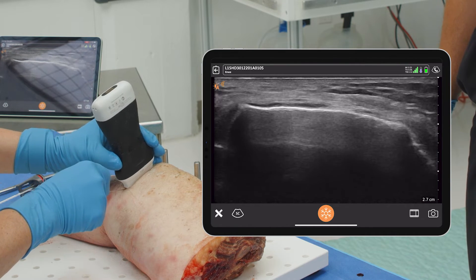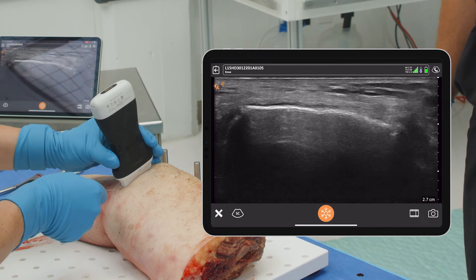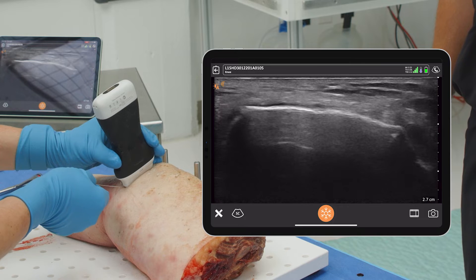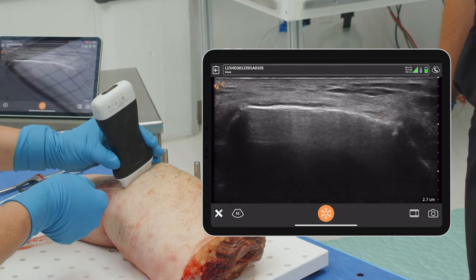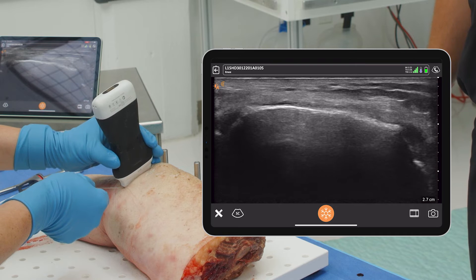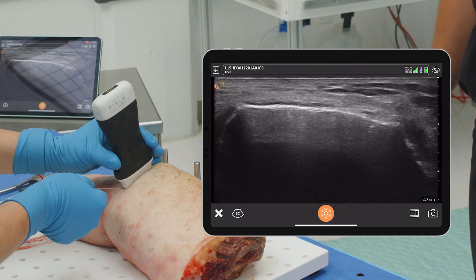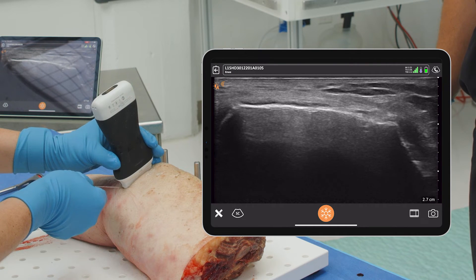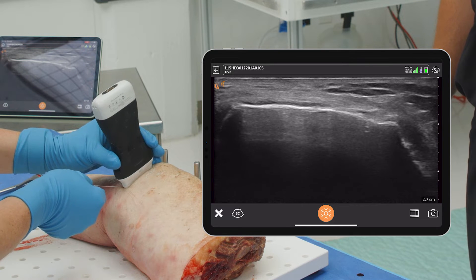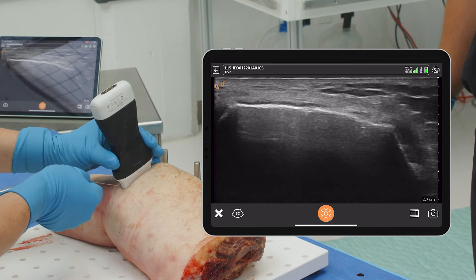There's my needle — and there it is. You can see the needle is exactly where I want it: there's the adductor tubercle, the end of it distally, the adductor tubercle coming more proximal, and just slightly anterior. So I'm in the exact anatomic location of the MPFL attachment right now. If you want to be a little bit more proximal, you can reorient it, but essentially it's right there.